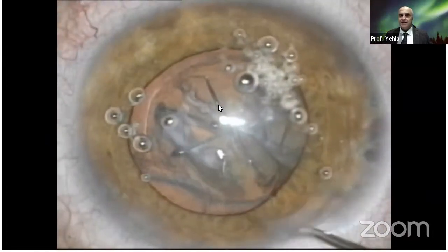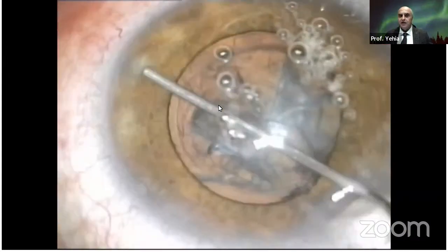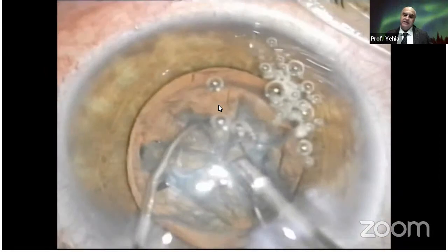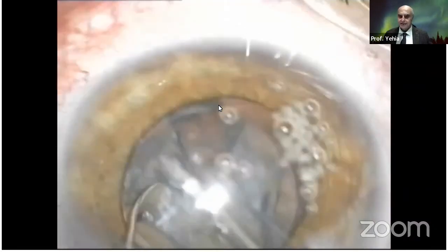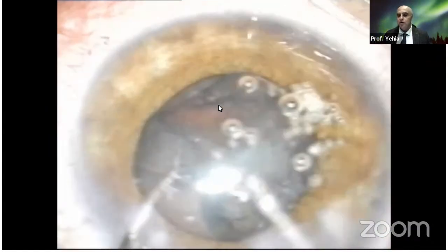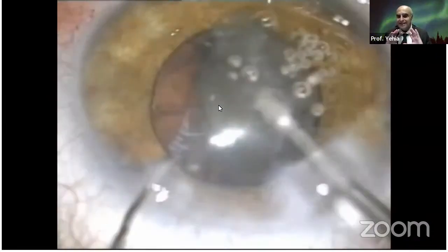Injecting viscoelastic in the angle, trying to displace and open the angle. You see, this is a high viscosity, cohesive viscoelastic. As you can see, it's already segmented, but that's not the problem. The main use of the femto here is to do the rexis, not the segmentation. And as in any glaucoma surgery, you have to remember to work in the posterior chamber. If you ever go to the anterior chamber, use only vacuum.